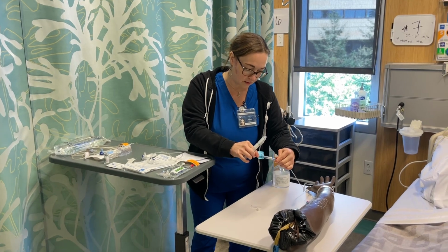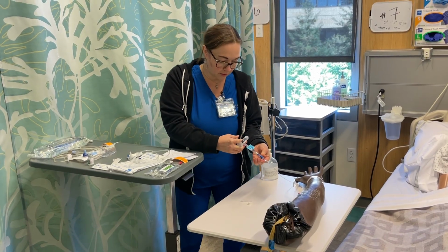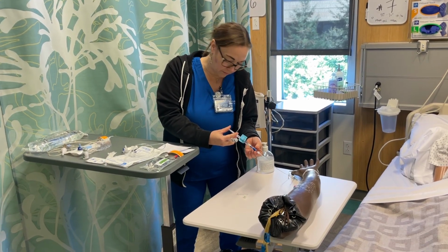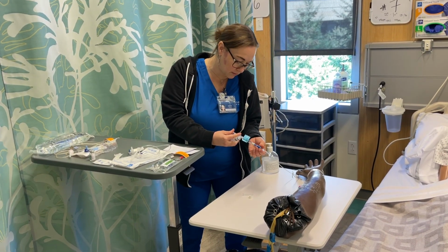Might need a new one. This needs to go a little bit slower, so at the very least a minute, and at a rate of 4 to 10 minutes would be ideal. Slower the better, not to irritate the veins.